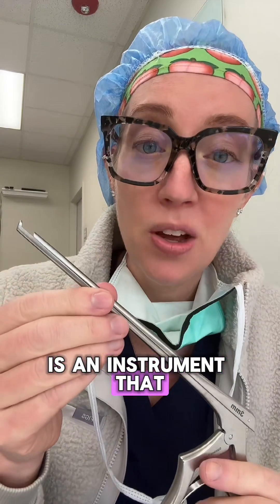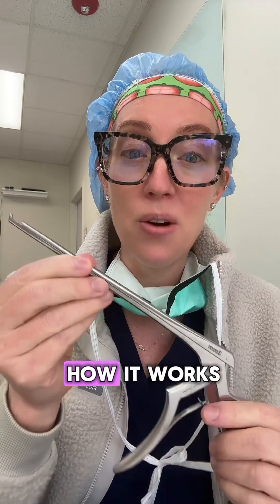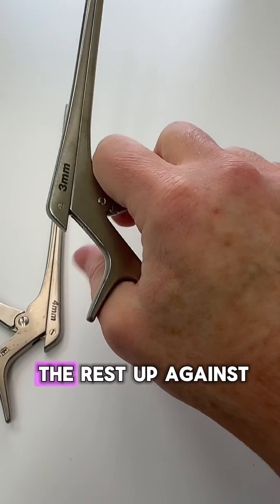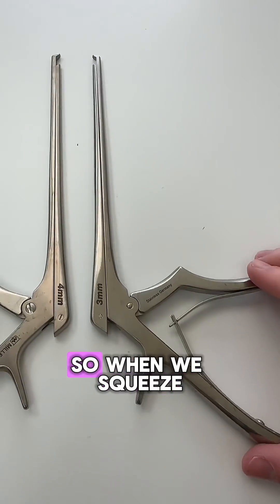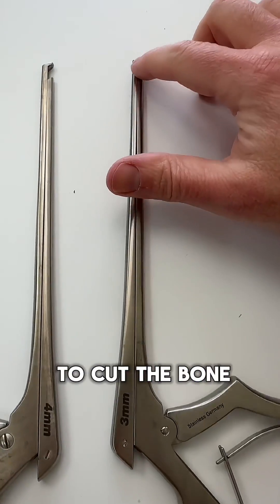The Kerrison rongeur is an instrument that we use on a daily basis in spine surgery. Looking at the instrument itself, it has a handle where the surgeon can grip, and the back part rests against the surgeon's thumb. Then there is the shaft of the instrument and then the cutting portion. When we squeeze the handle, you can see how that shaft is deployed to cut the bone at the tip.